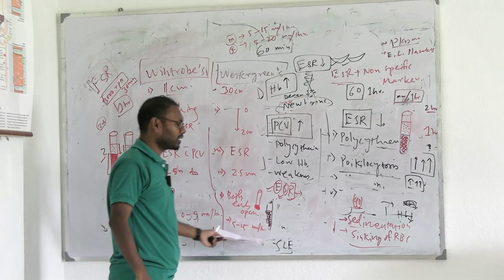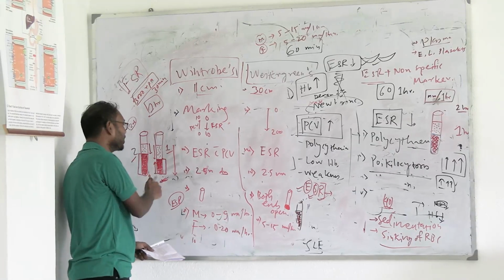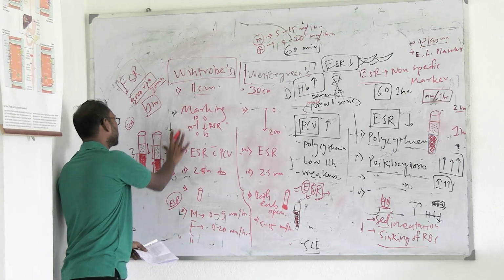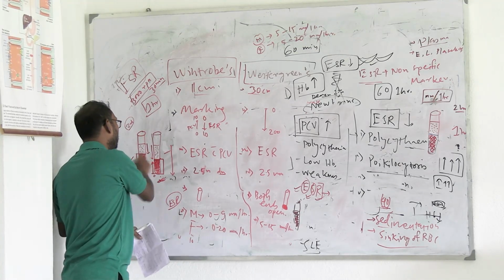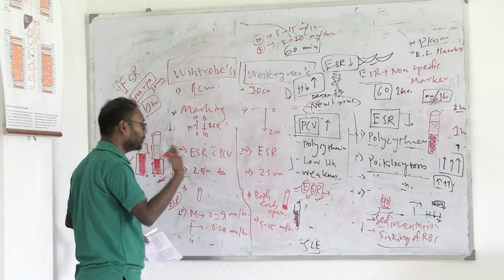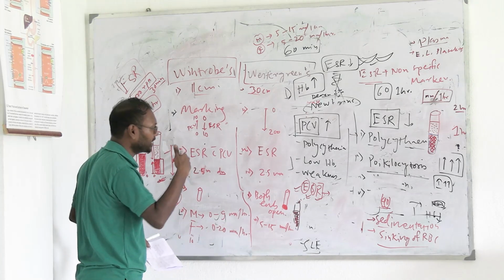okay, that means we have measured it after 1 hour. Now rate also includes another thing. If you see after 2 hours, সেলগুলো আরো নিচে নামবে। So after 2 hours, now we are removing the numbers, this test tube may look like this. So that means after 2 hours the rate will be the same, but when you measure, this length will be greater. Okay, so that's why it is also called a rate.